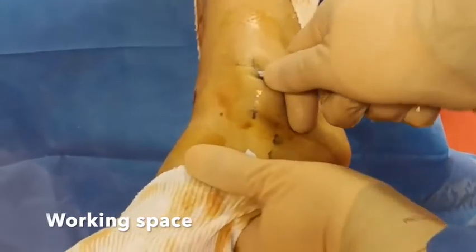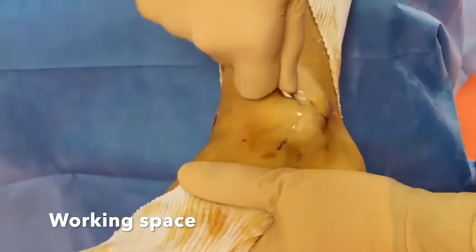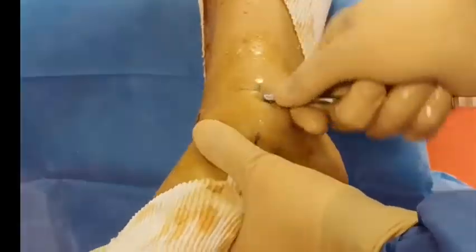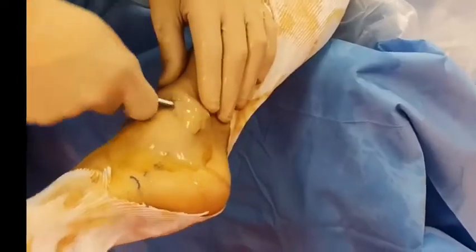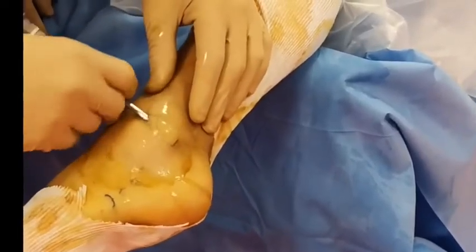Before starting the endoscopy, a working space is created using a smooth trocar between the skin and the inferior extensor retinaculum. Circular movements will enlarge this area for later access and will keep the cutaneous nerves away.